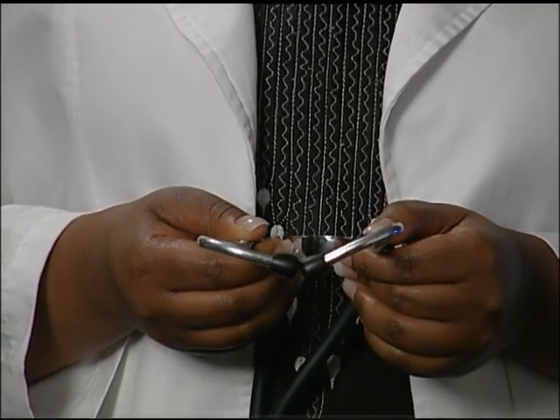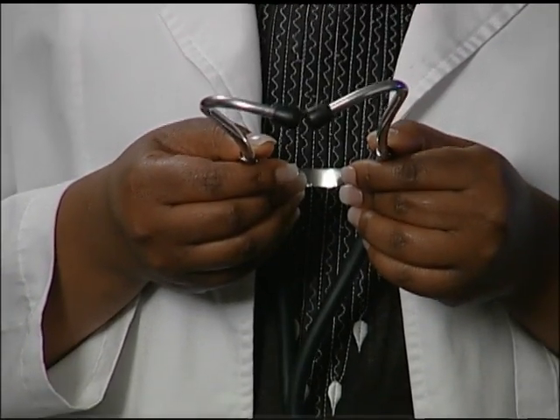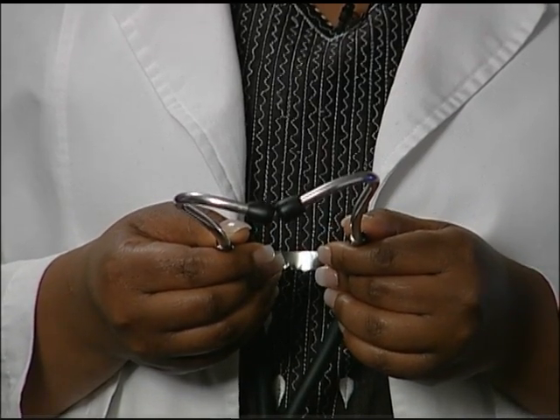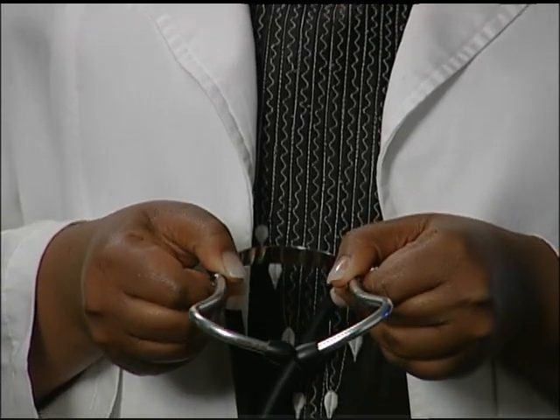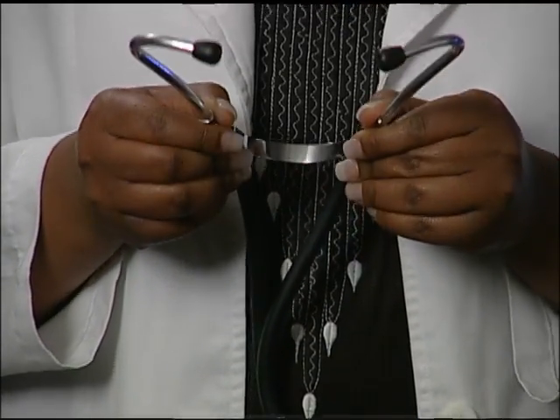The ear pieces at the other end of the stethoscope are put in your ears so you can hear the sounds. Notice how the ear pieces have an angle to them — these fit better when they are placed facing forward.